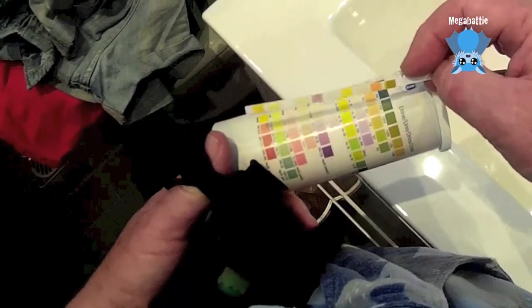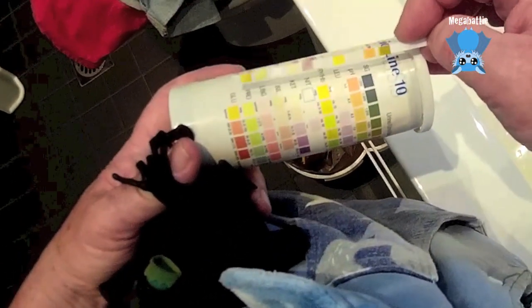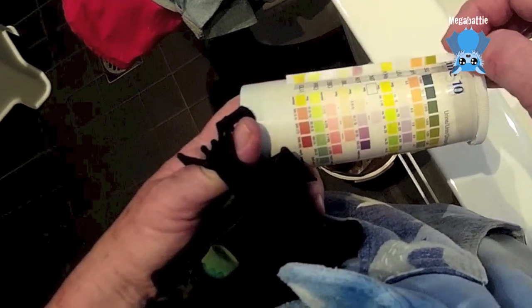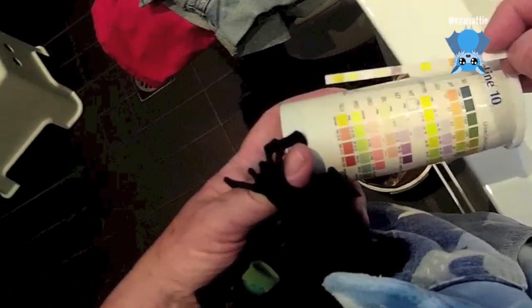Ah, you're showing ketones. Well that would be because you're hungry. Okay. Everything else? Normal. Okay.